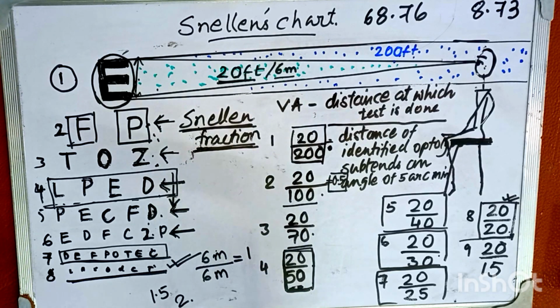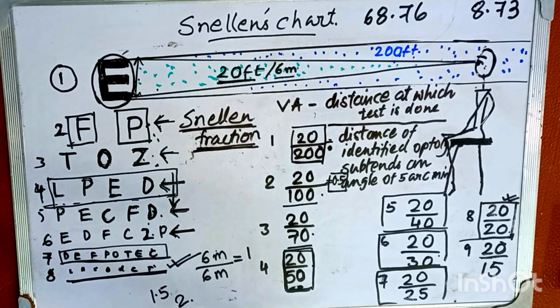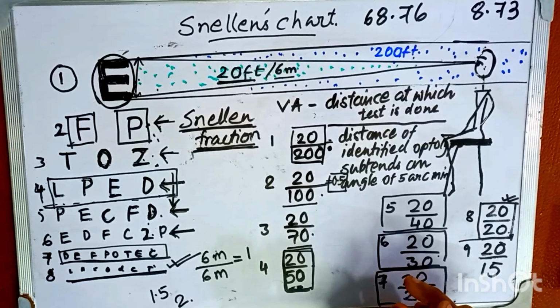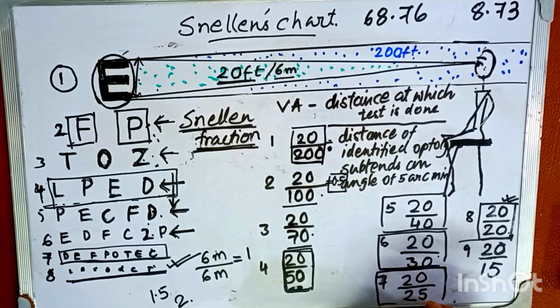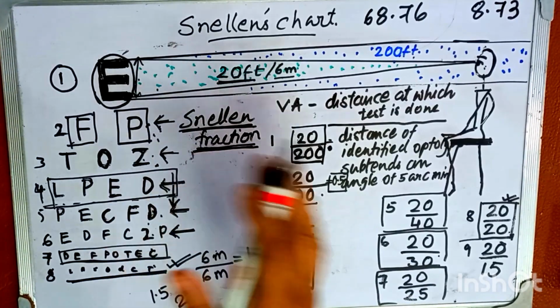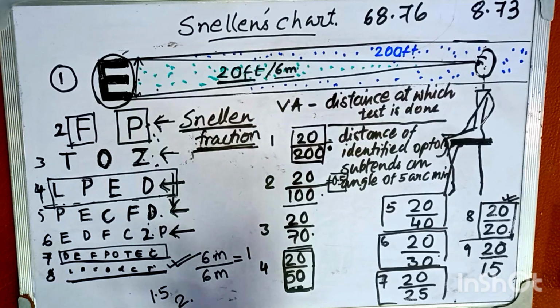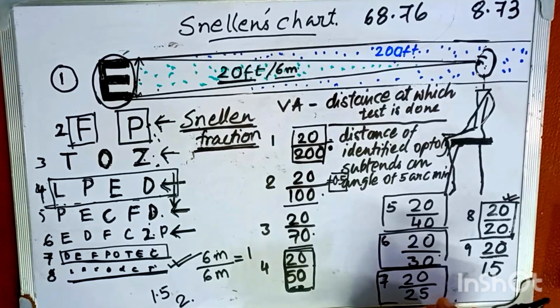In those cases, the visual acuity for distant objects gets lowered. So we need to take some lenses so that our vision gets corrected. And by reading the Snellen's chart, we get an approximate idea about how much the vision is lowered.